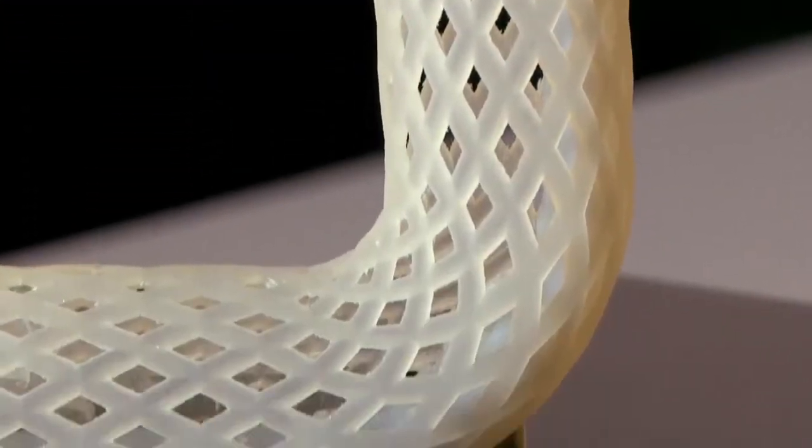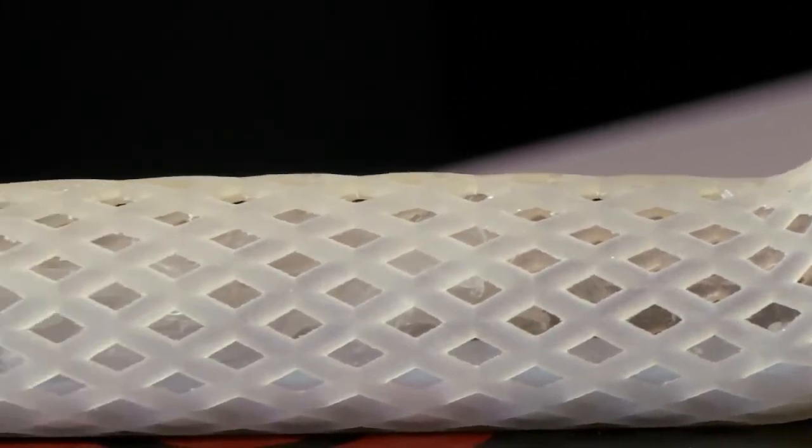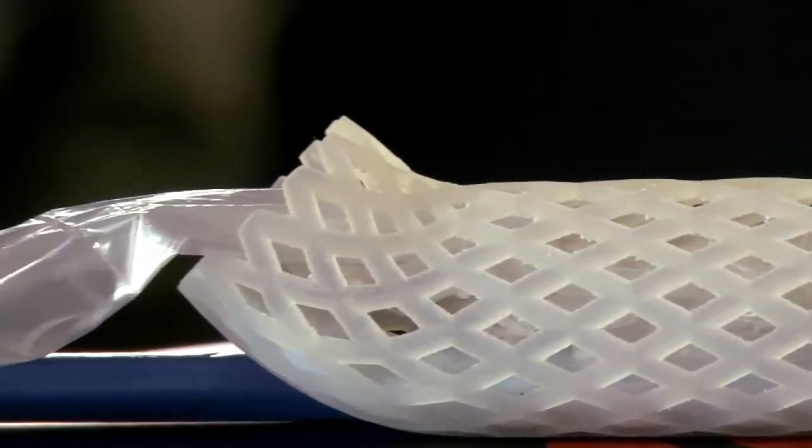The endoscopic insertion requires no general anesthesia, no incisions, and no tissue damage. The natural C-shape anatomy helps keep the sleeve in place and blocks food absorption without damaging the intestine.